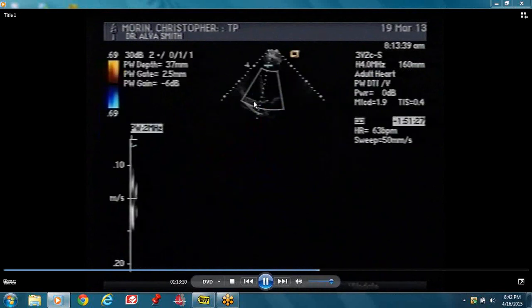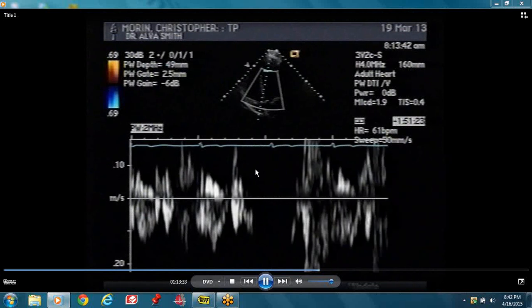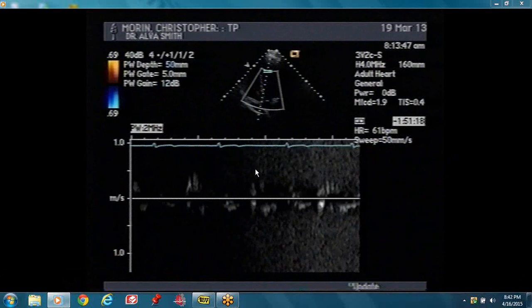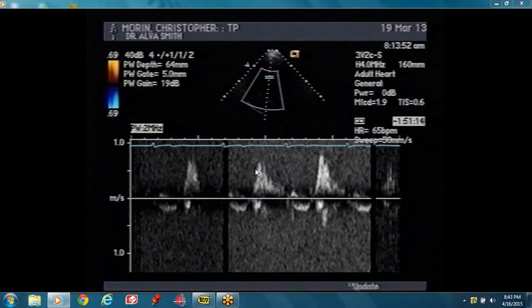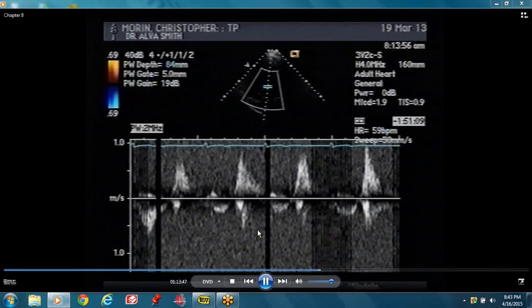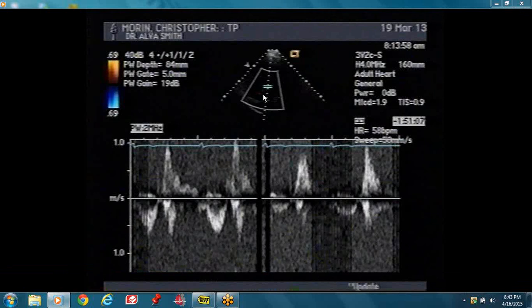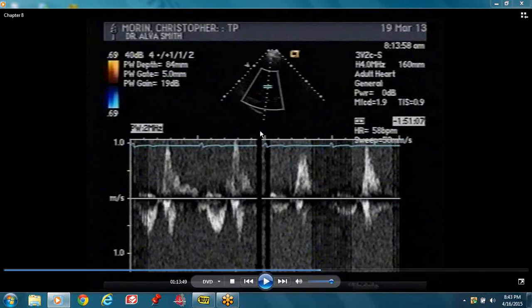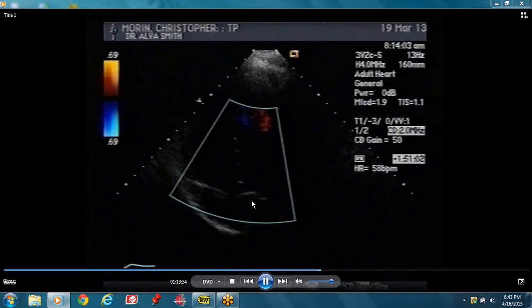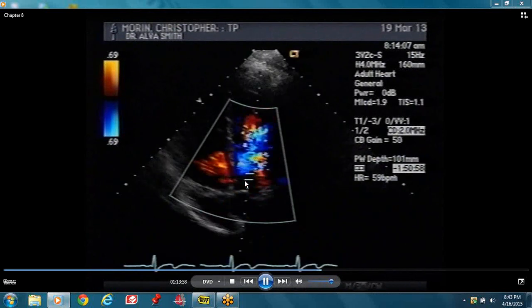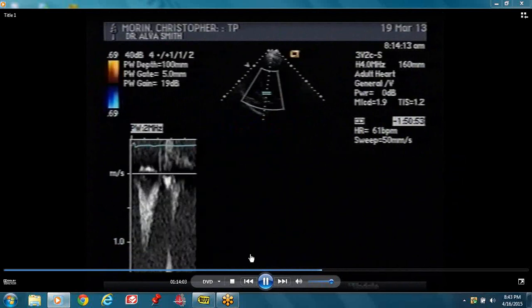You put your cursor across the left ventricular outflow track and measure the LVOT velocity and the VTI. A routine technique is to move the cursor from the apex down toward the left ventricular outflow track — if you have intracavitary obstruction in the LV, that's one way of showing that. The cursor is a little bit above the aortic valve in the left ventricular outflow track and we get this envelope.